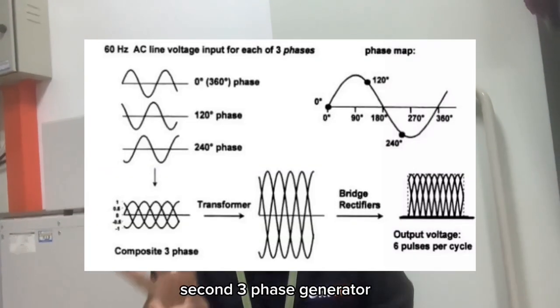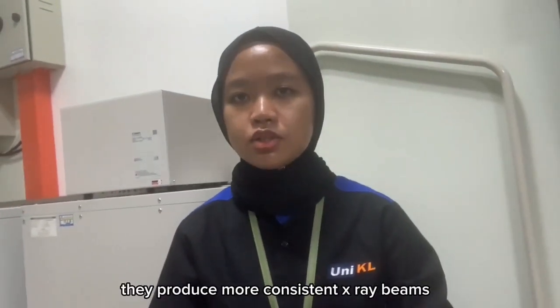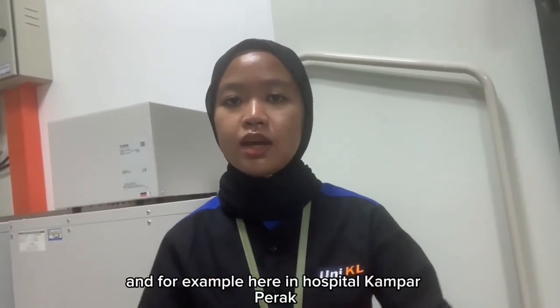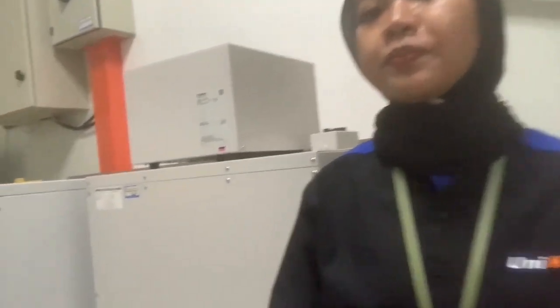Second, three-phase generators. These improve the voltage stability. With less voltage ripple, they produce more consistent X-ray beams, leading to clearer images and more efficient exposure. For example, here in Hospital Kampar, Perak, the X-ray unit is equipped with a three-phase generator.